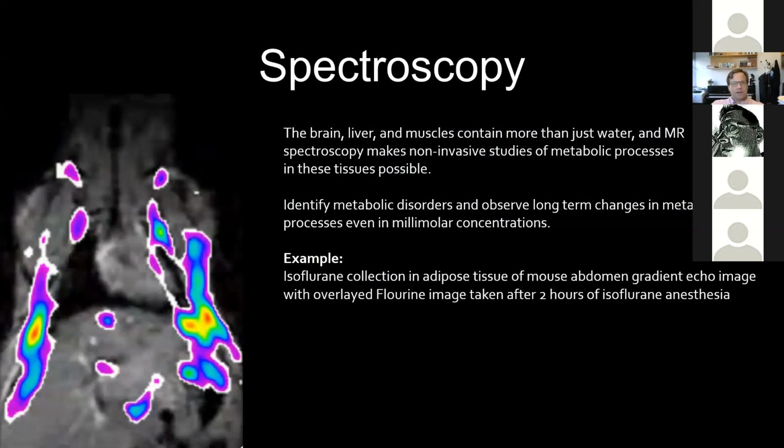And then finally, the modality that I'm going to end on is magnetic resonance spectroscopy. The reason I wanted to end on it is because I think that this is probably one of the most critical technologies for our MR center in terms of being useful and providing a very unique and rarefied advantage to cancer center investigators.